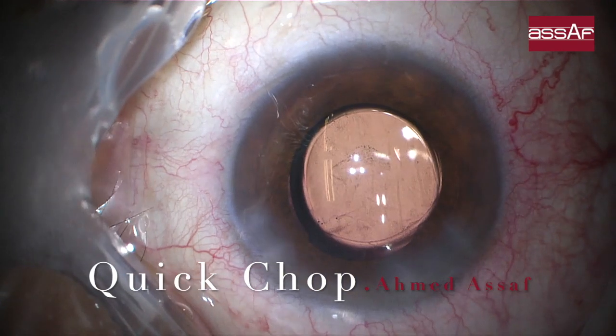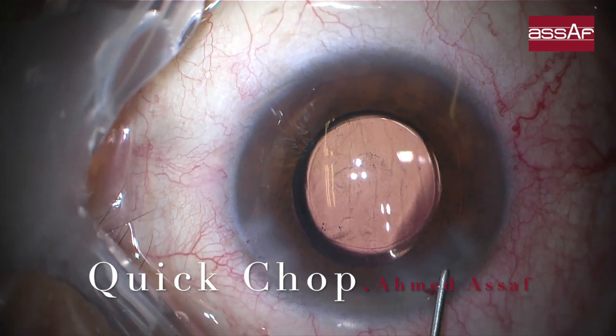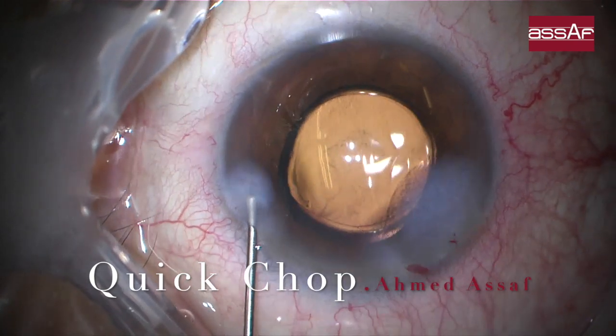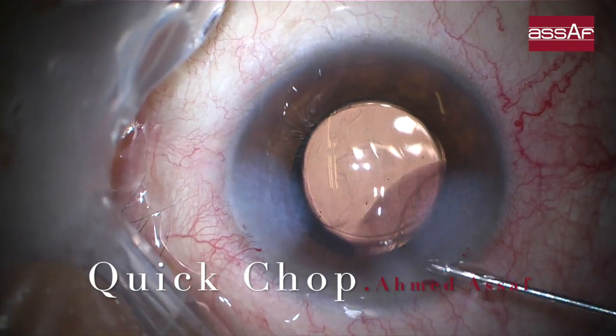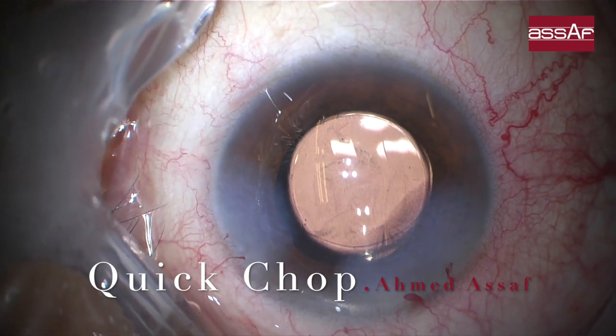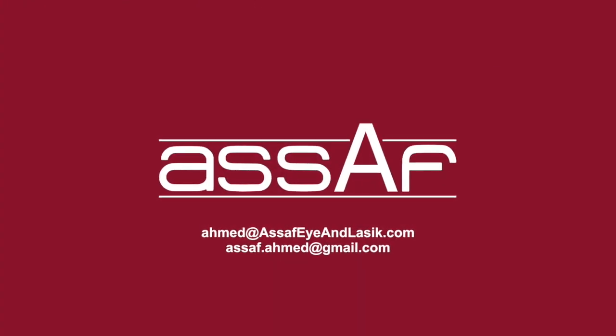This is the non-edited part showing phacoemulsification in a case of a poorly dilated pupil with nuclear grade 2 to 3 cataract. Stromal hydration of the wound is performed before conclusion of the surgery. The pupil is around 5.5 to 6 millimeters in width, the lens is well centered in place, and the surgery is now concluded.